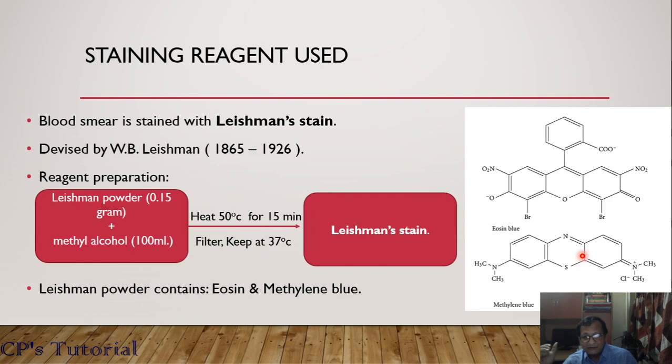So we require to maintain the staining time span in a proper way. The staining time will be discussed later on.